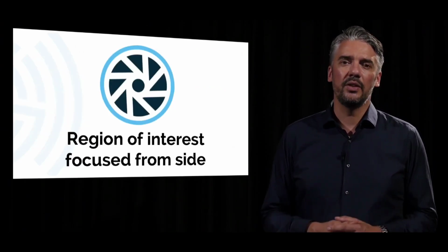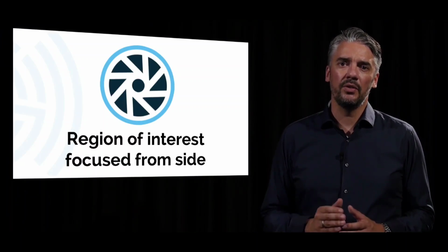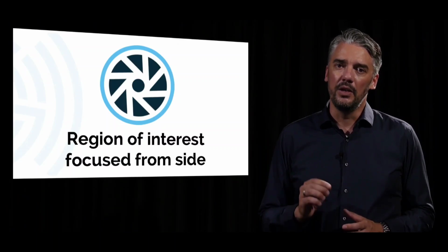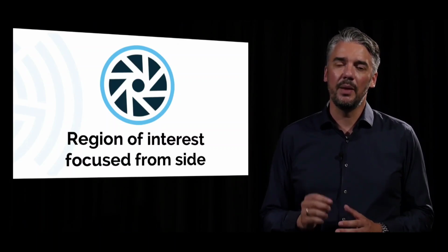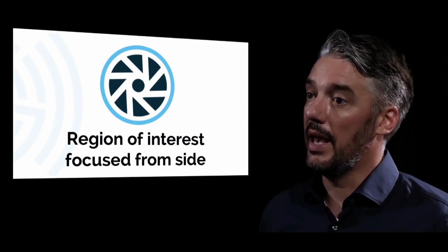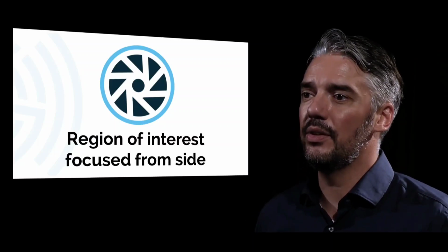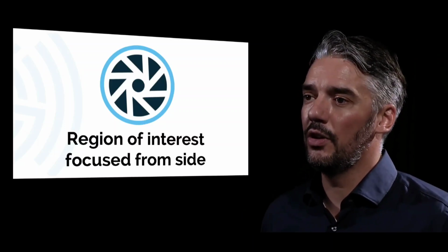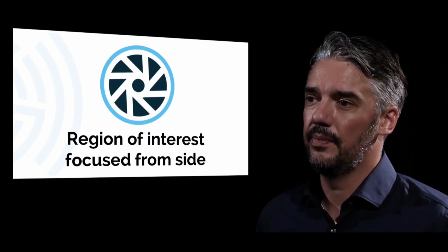The region of interest should be focused. By focusing the region of interest, the greatest degree of clarity is obtained. Not focusing on the region of interest results in a less clear image. Although it might seem like the difference between focusing and not focusing is small, it has been proven in clinical practice that these small changes are in many cases crucial in deciding whether there is pathology present or not.